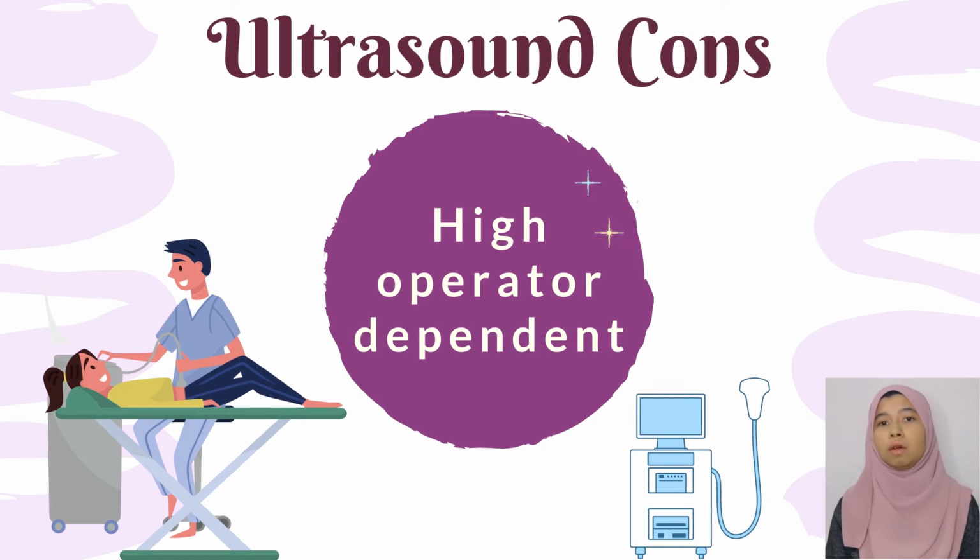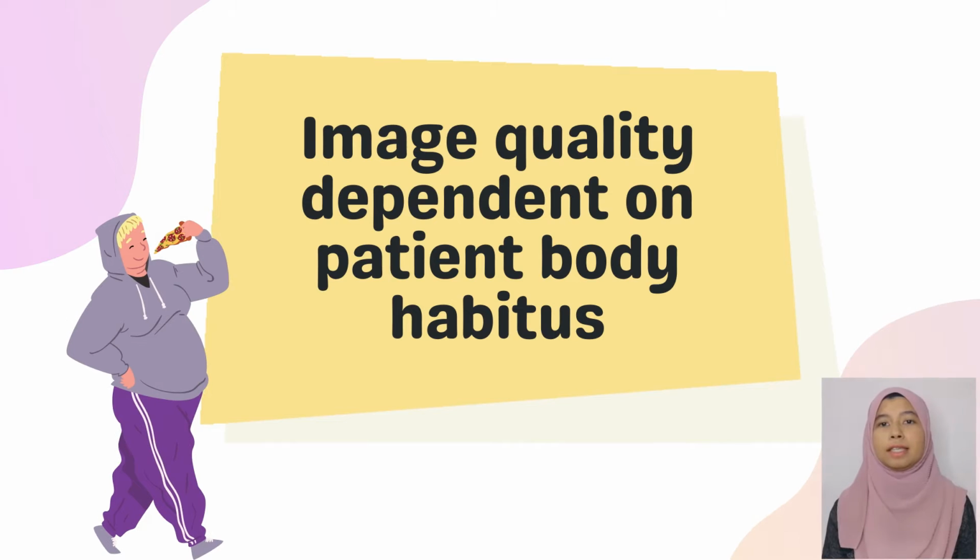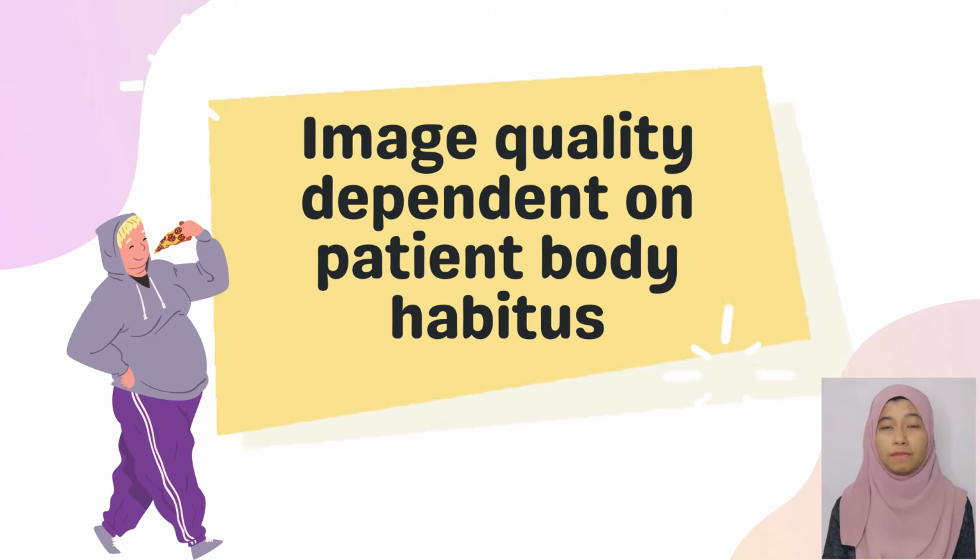However, ultrasound also has unavoidable cons where it is highly operator dependent, which misdiagnosis may occur, which can also lead to false alarm. Next, image quality is dependent on patient body habitus such as obese patient and bowel gas, where it can cause difficulty in visualizing the aorta.